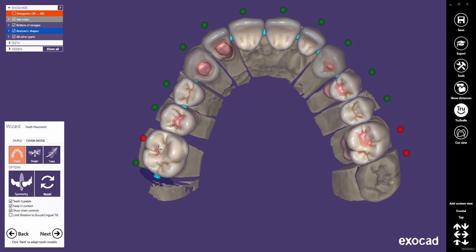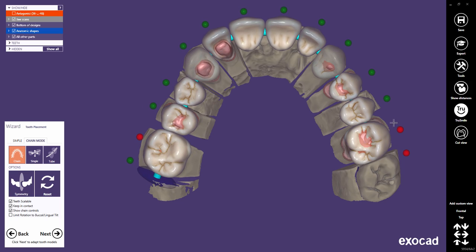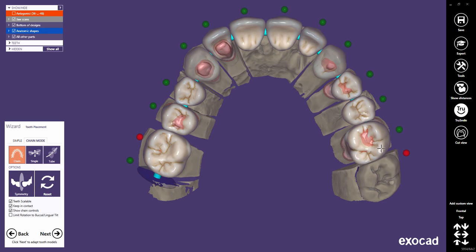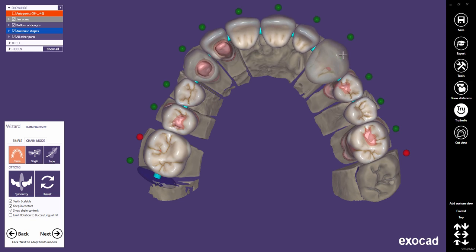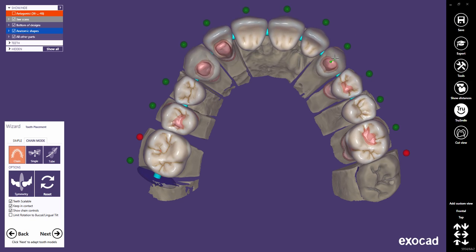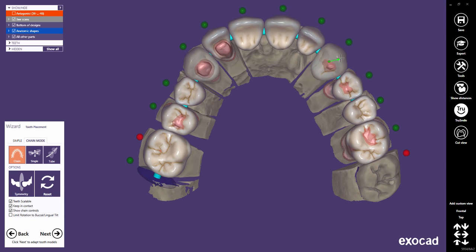Note: if a tooth is pinned, it can still be transformed when selecting it directly, but it's protected from being influenced by the neighboring teeth's movement. Use SHIFT and the left mouse button to scale a single tooth in the chain if both ends of the chain are pinned.